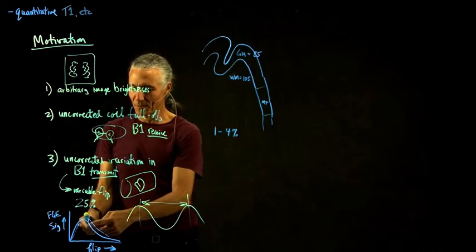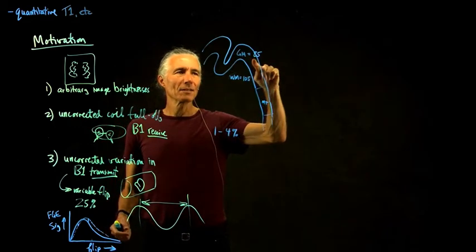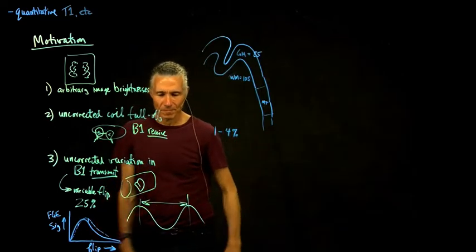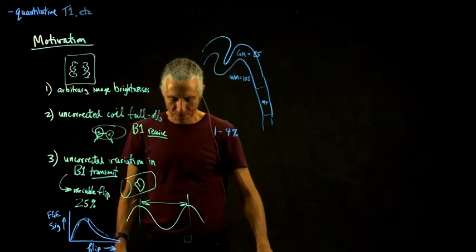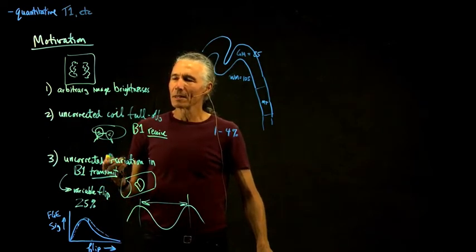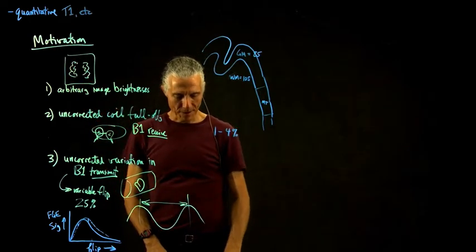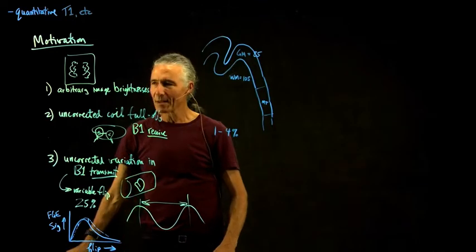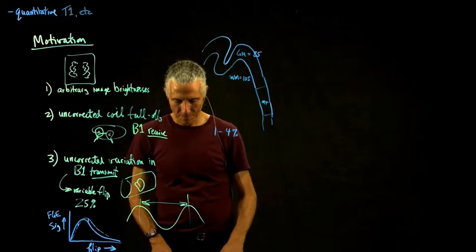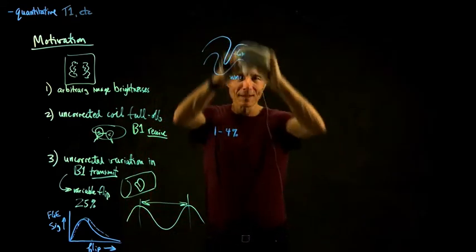And the flip angle could even reverse the contrast, you know, so it could easily reverse the contrast and change, like, 85 into 105. So that gives you some motivation for why we want to try to derive some method that is a better, more quantitative method across the brain, as opposed to just trying to kind of post hoc fix the image. So that's the motivation for why we want to do this.